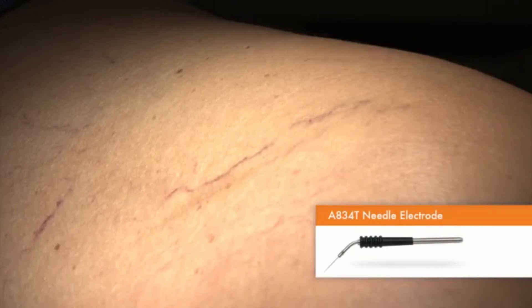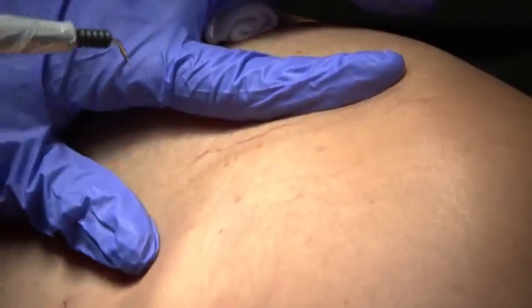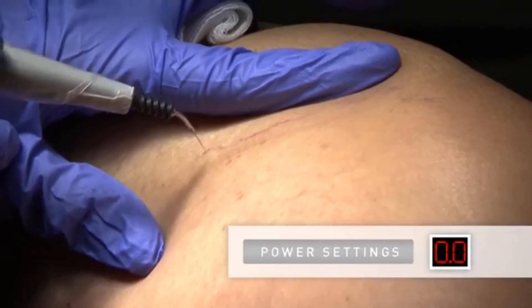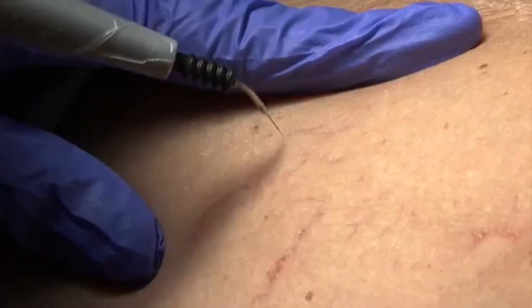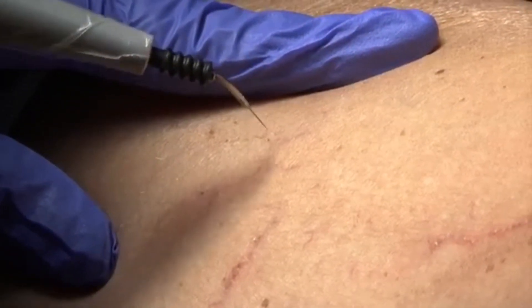The A834T needle electrode or similar fine point electrode works well for removing small telangiectasias. We use no anesthesia, as doing so would temporarily obliterate the blood vessel we are treating. Using a power setting of 0 to 3 watts, apply current directly to the vessel for a fraction of a second. With the proper power setting, the vessel will immediately disappear with minimal damage.